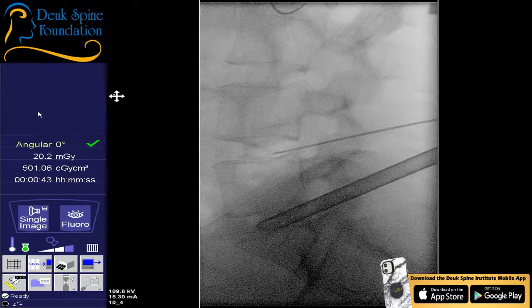All right, perfect. So this technique of me starting with the end of the tube inside the disc and pulling back as I'm fixing the disc, that technique of inside out was taught to me by Dr. Young. And that's what he's famous for doing, the inside out technique. Now, the annular repair that I'm about to do, the debridement, that's something I developed on my own.